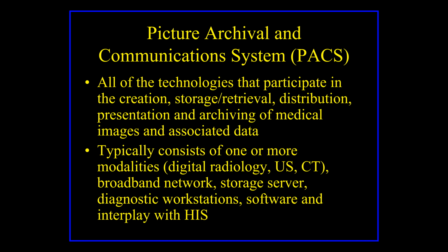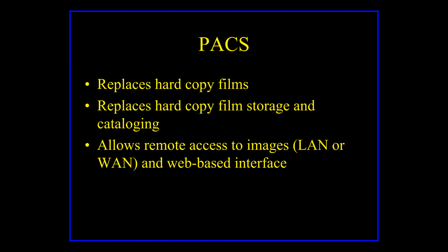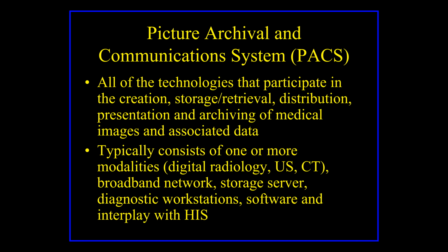So it's the software that stores images and then has the ability to catalog those images. You can search those images by the date, by Fluffy, or by the dog's last name. So it catalogs and finds images. It's basically a big database for all medical images. And PACS systems are universally used around the world for anything on the human side, and now on the vet side as well.